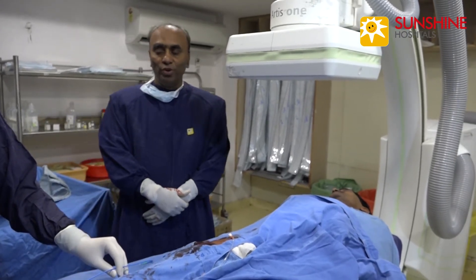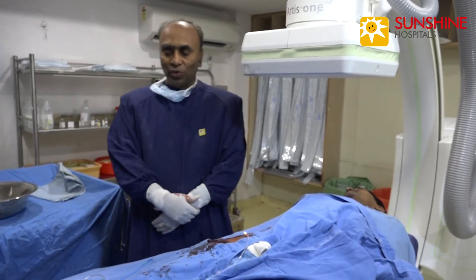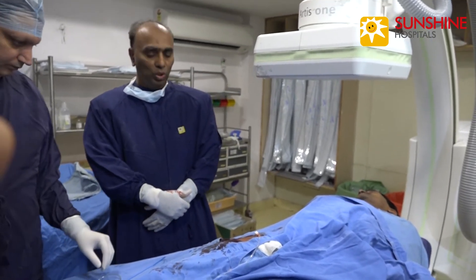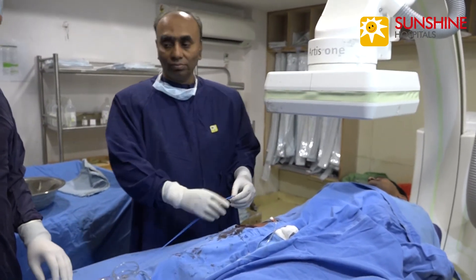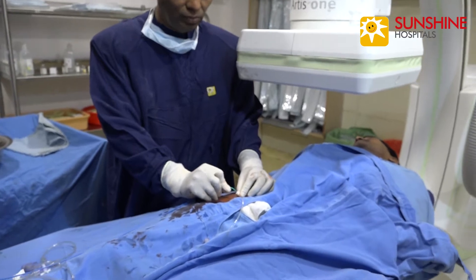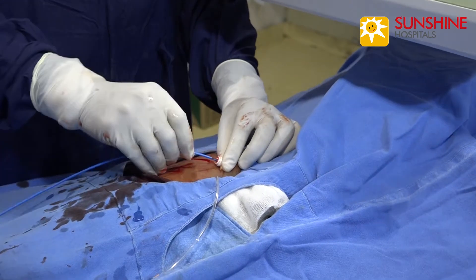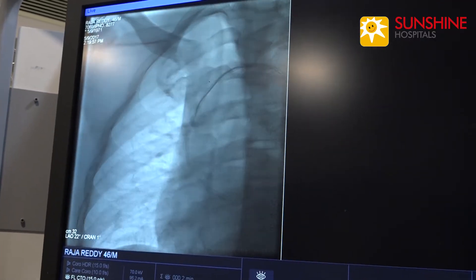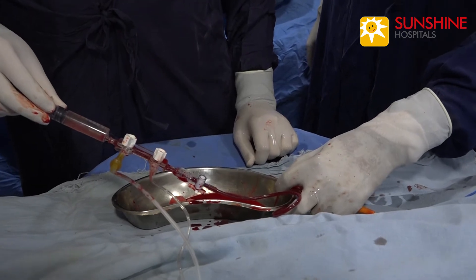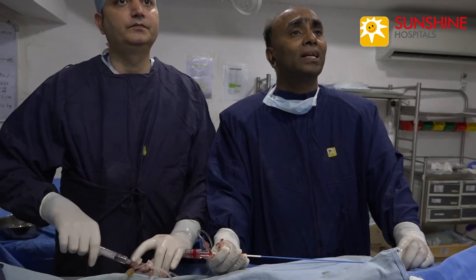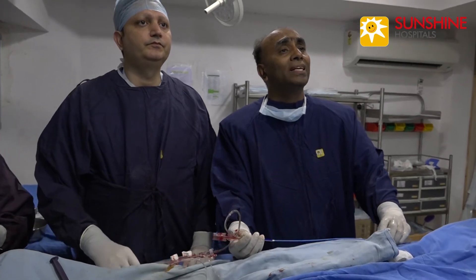For that we are doing the intravascular imaging, which is a very useful and effective tool. Anti-platelet drugs and heparin 100 units per kg were administered.